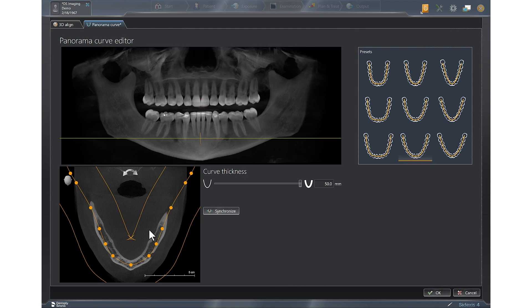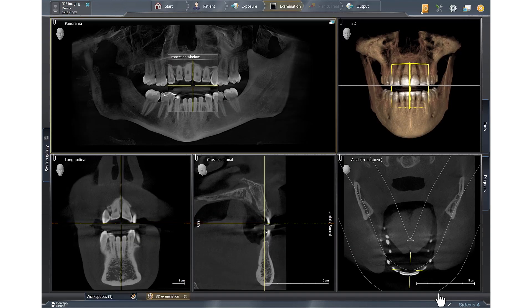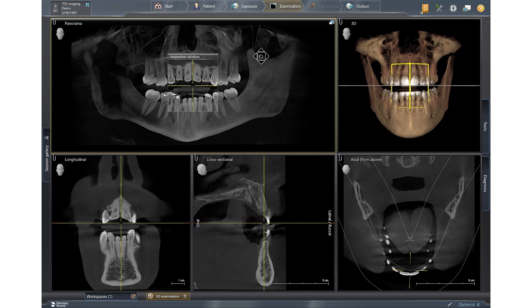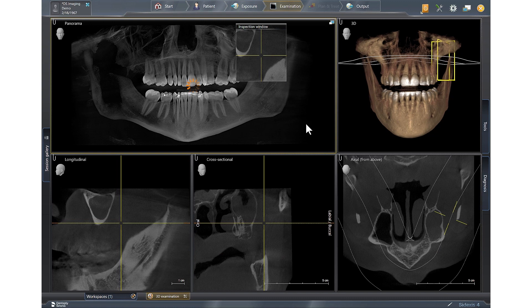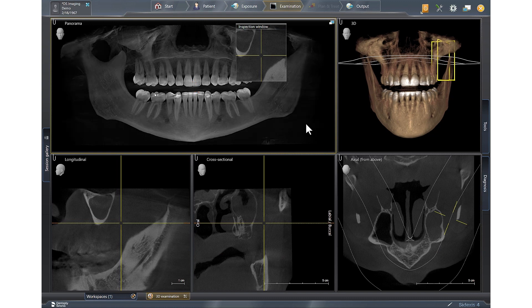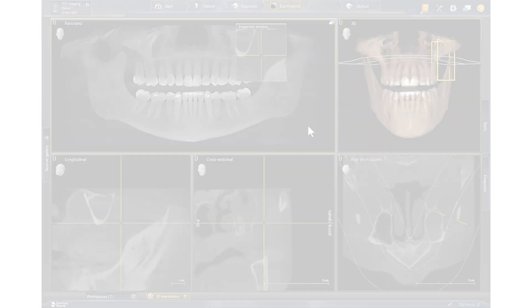Whatever you choose, when you're happy with the image, you'll come over and select OK, and that will save your pan into the 3D examination window.